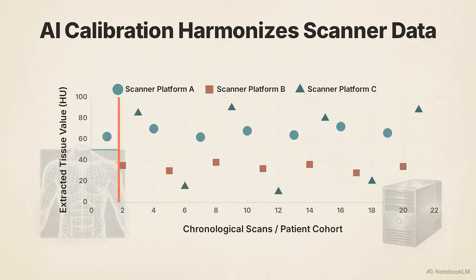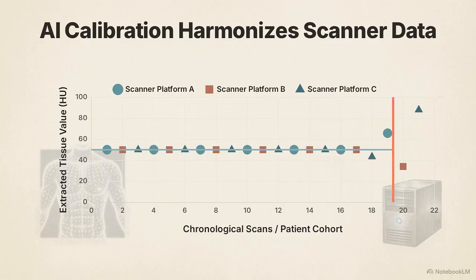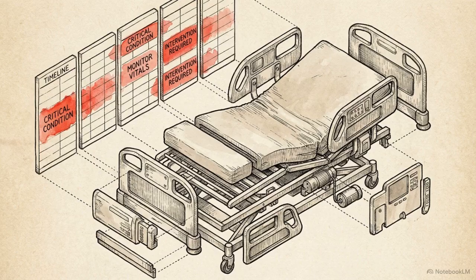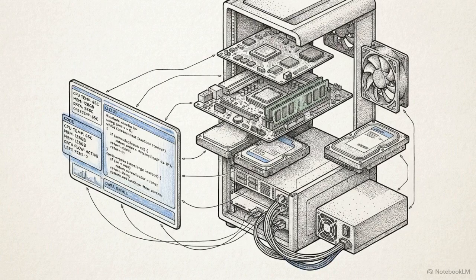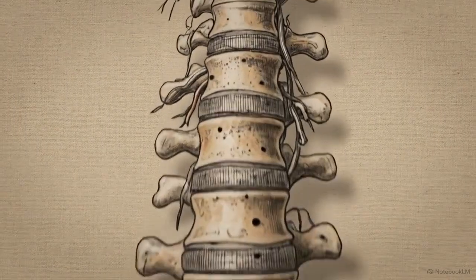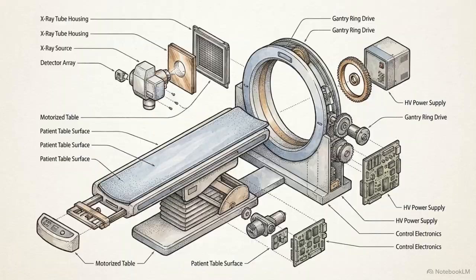Emerging calibration techniques using individual tissue attenuation characteristics are actively in development to correct this interscanner variability. Body composition metrics are powerful predictors of hospital length of stay and mortality, but they only function if the physicist or the AI accounts for the exact parameters of the contrast phase. Our final anatomical stop zooms in directly on the central core of the T12 and L1 vertebral bodies.